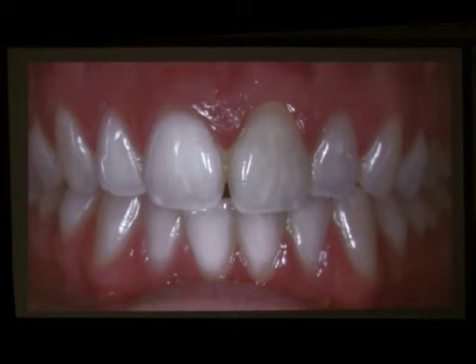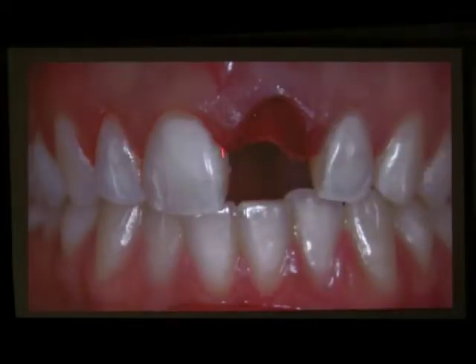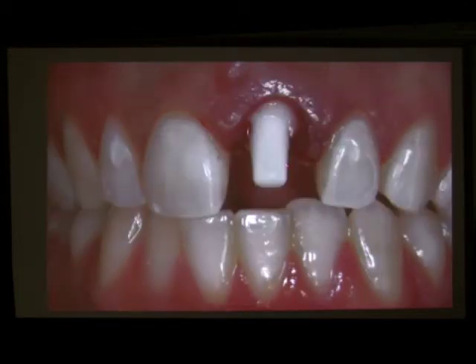When we have to extract a tooth like this, and we have this type of scallop shape on the gum, with a root fracture, it's very difficult to know how deep to place the implant. On the buccal of the tooth, probably the bone is about 2 millimeters subgingivally, but interproximally the bone is not that far. So we want to place the implant in this area. We know that if we put this implant deeper, we will have problems interproximally.